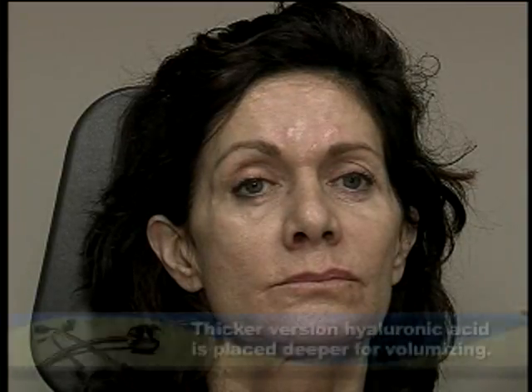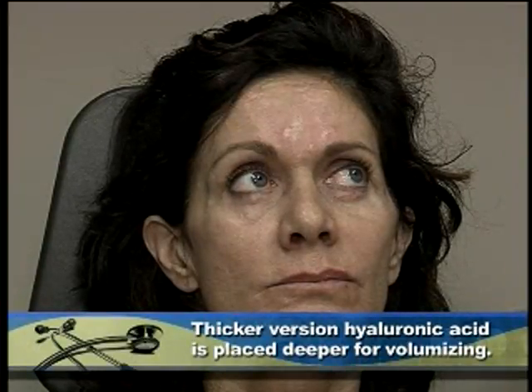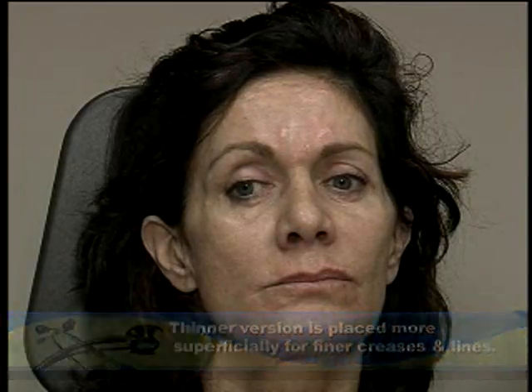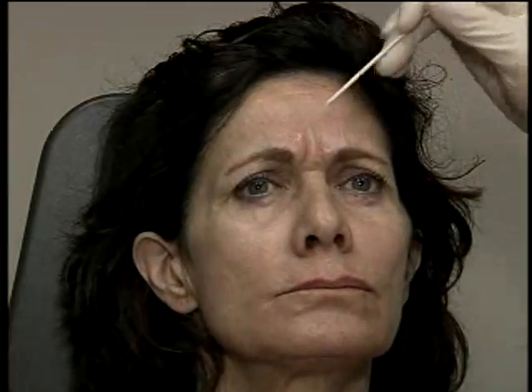Now, I use the hyaluronics. There's two different versions that I use. There's one that's a thicker version and one that's a thinner version. And the thicker version we place deeper for volumizing, and the thinner version we place more superficially for some of the finer creases and lines of the face. So I look all over, and I'm helping to determine myself what I'm going to use where as I diagnose the areas of concern.